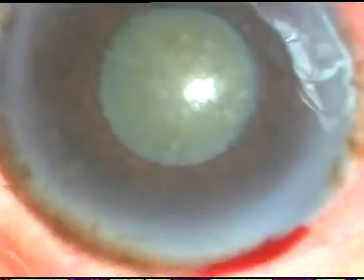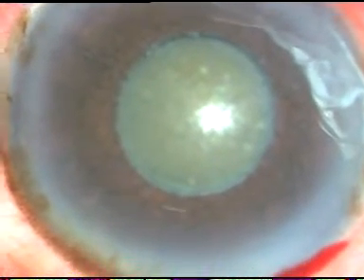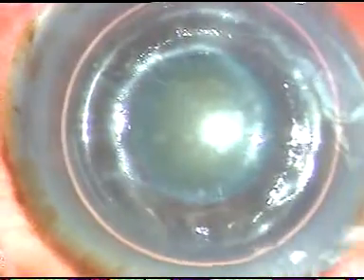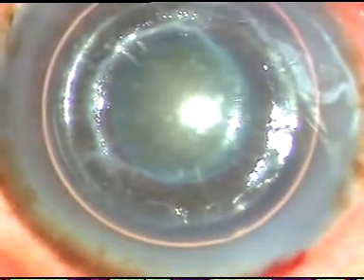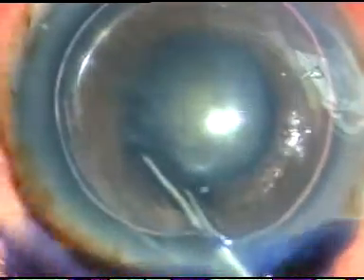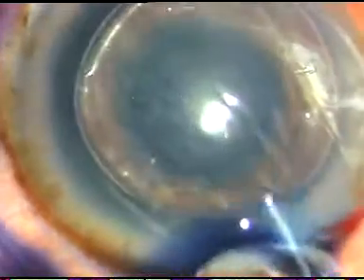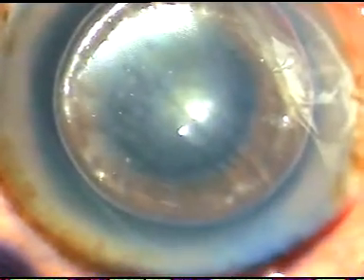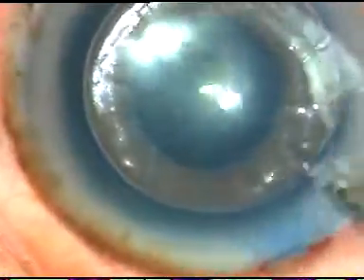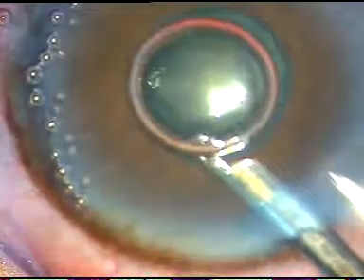I have planned to stain the anterior capsule with trypan blue dye and apply iris hooks. I always apply trypan blue dye underneath an air bubble. In this case, I have to inject the dye underneath the iris. I have injected the dye at 3 o'clock and at 8 o'clock underneath the iris so that this dye spreads all around and the anterior capsule is stained all around.